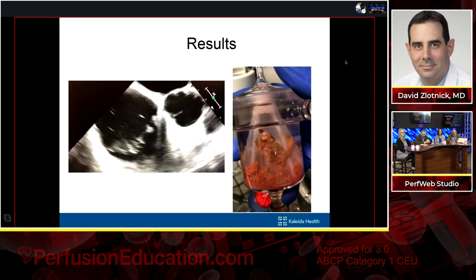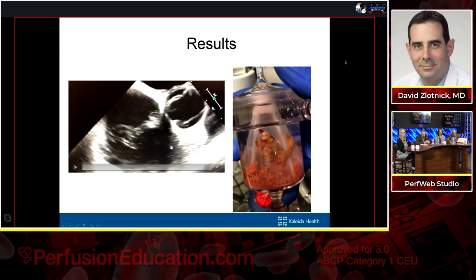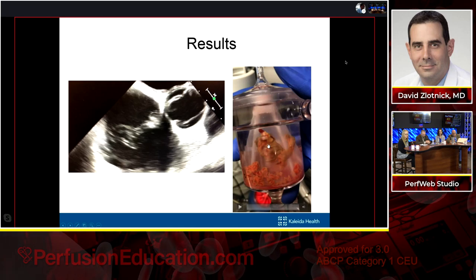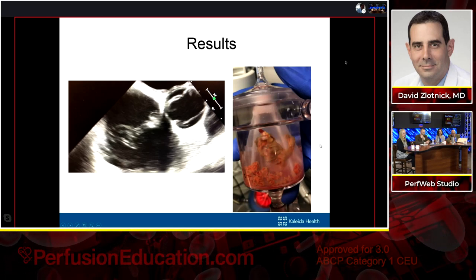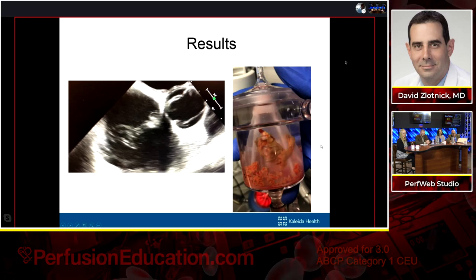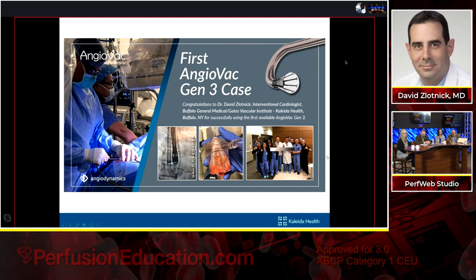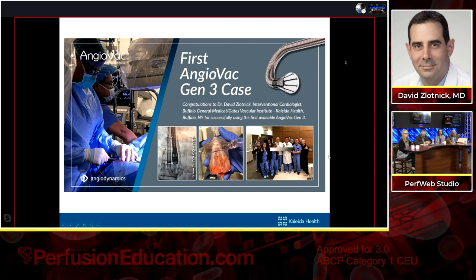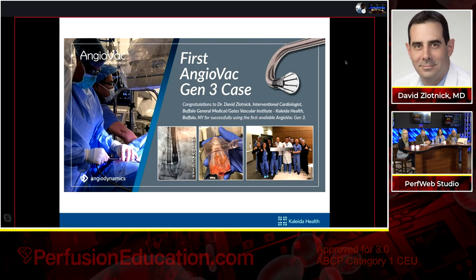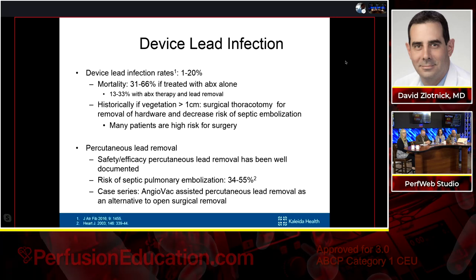I'll just pause that video, but we had a rapid debulking, and you can see that we had a lot of the material in the filter afterwards. Wow. We all say it, don't we? Mark was there for this, our first AngioVac Gen 3 case.